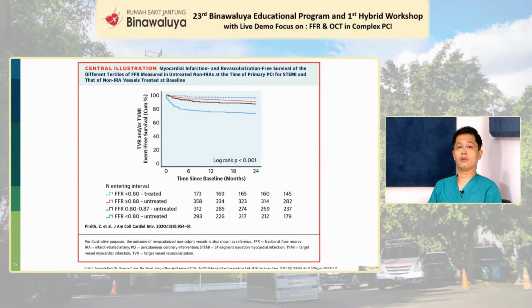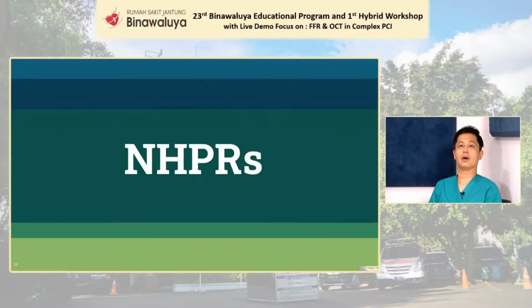But of course, residual FFR, if left untreated, if they were higher at the beginning, I think it would most definitely be better. Understandably, if it's lower, then it is not going to confer that good of an outcome.